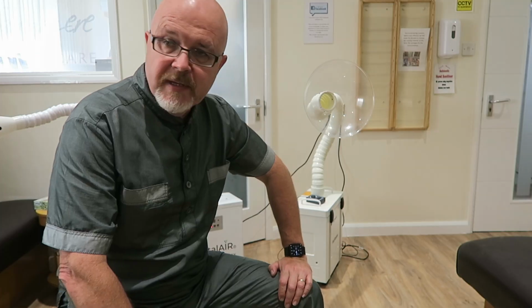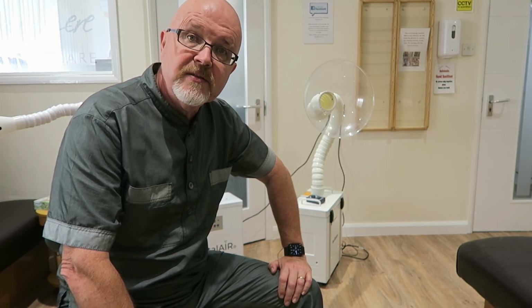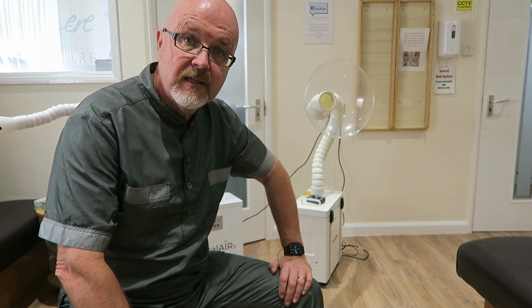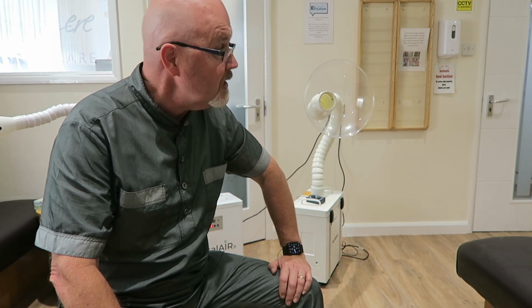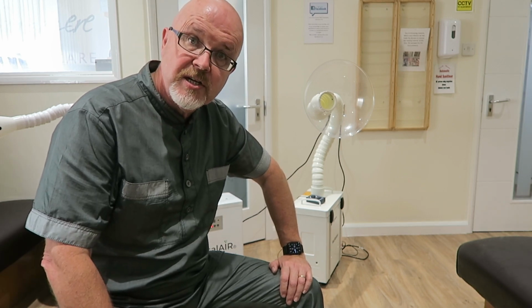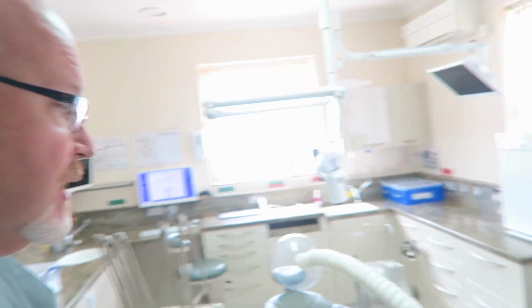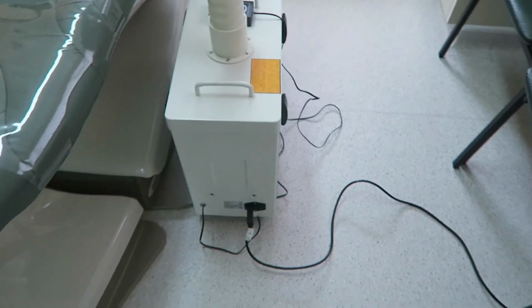Okay, so the next bit then will be actually taking these units through and seeing how they fit in the various surgeries. So this is going to be a little bit Heath Robinson, but I'll do my best to actually show you the placement of these units. This is in my surgery. As you'll be able to see, that's placed by the side of my chair.